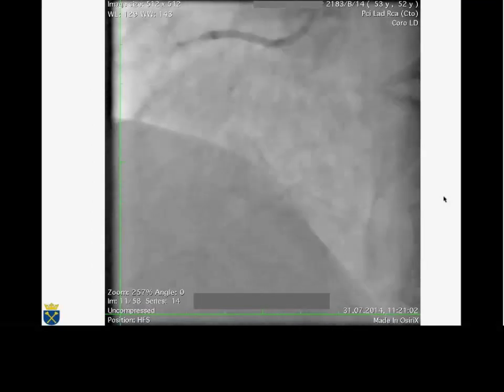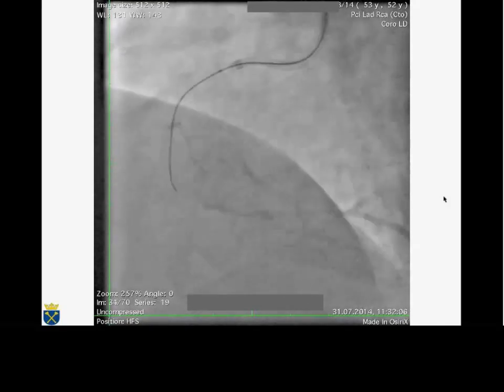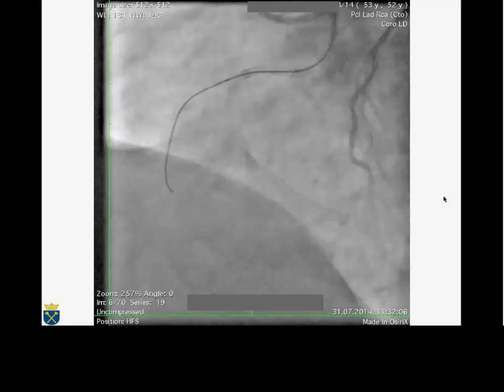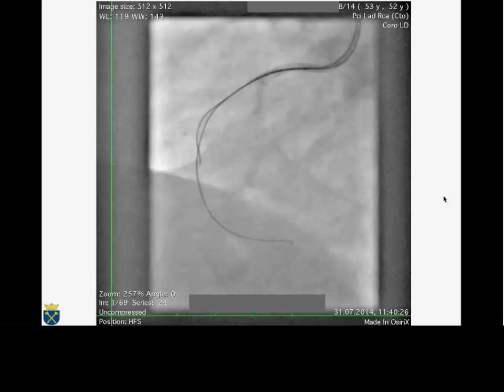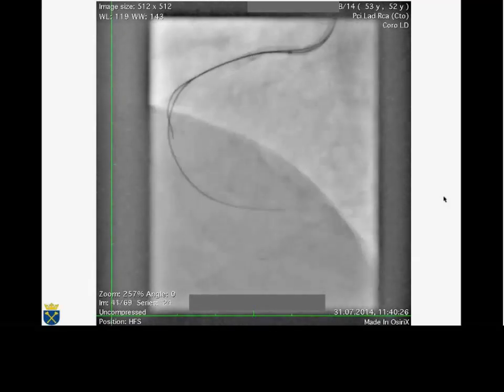the right coronary artery occluded. It was done with two wires technique. You see the one is outside the vessel lumen. This is the old fashioned parallel wire technique, but sometimes I like it. And it was very... I see you put a BVS on the LAD.